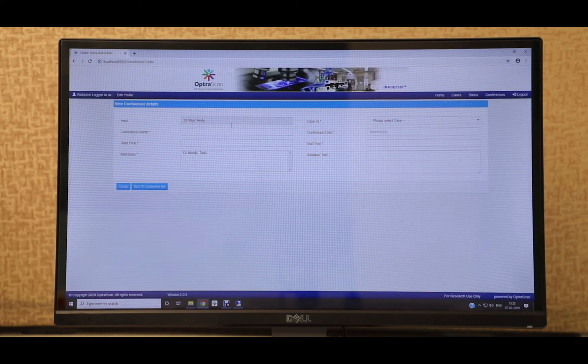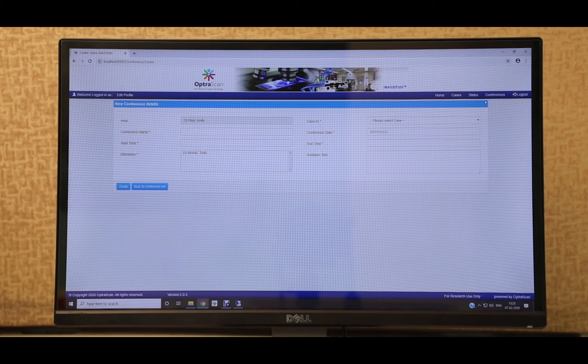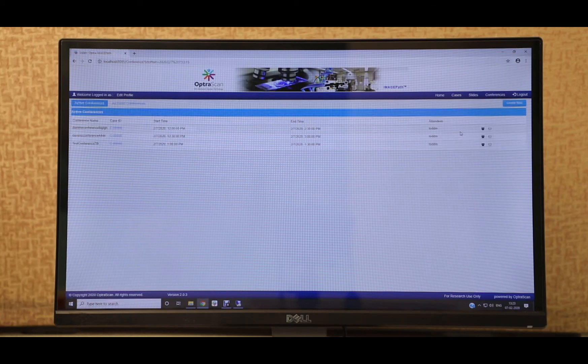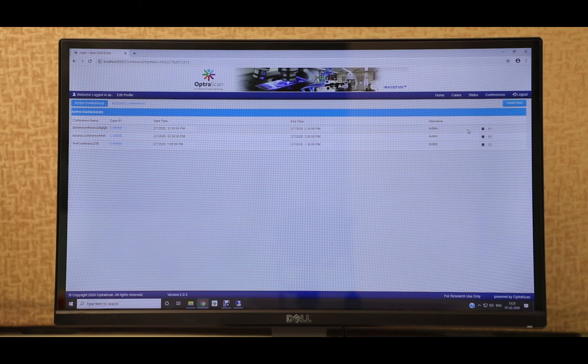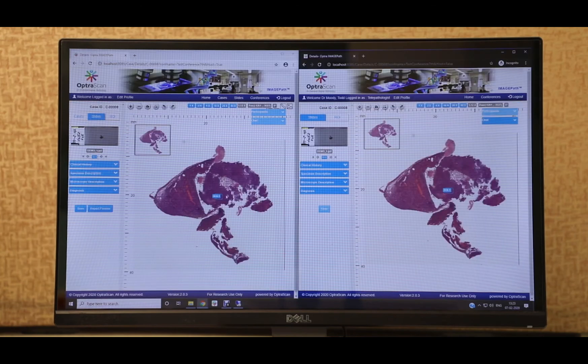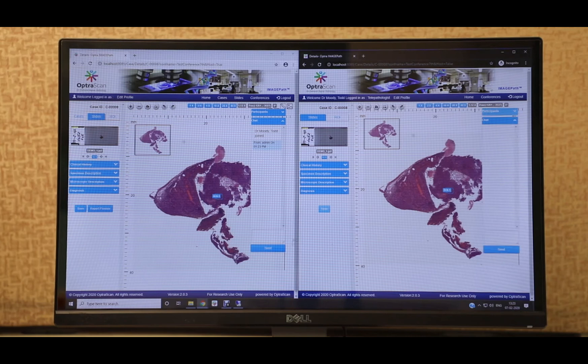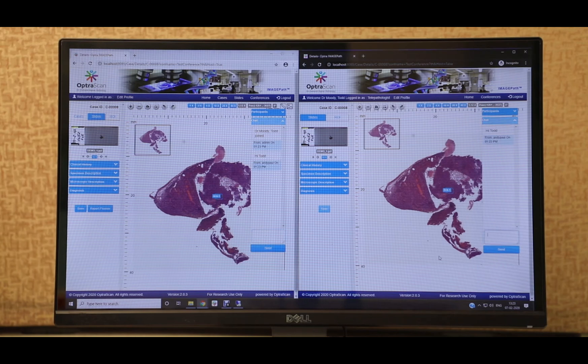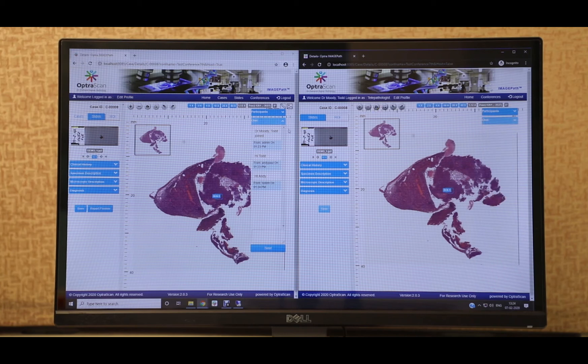With ImagePath, there is a TelePath feature integrated, allowing pathologists to easily share cases with other pathologists for consulting. This allows for a real-time conference between multiple pathologists. There is a chat box that allows users to communicate their opinions to each other. The chat is also saved for the host pathologist's reference when generating the final report.